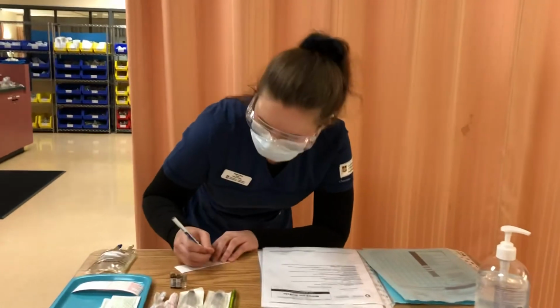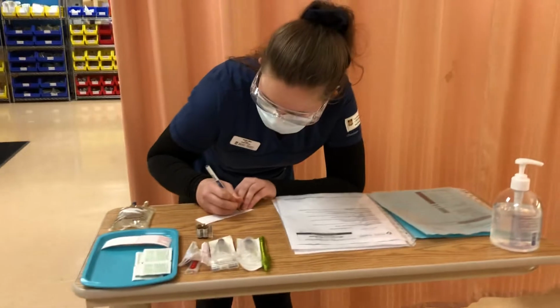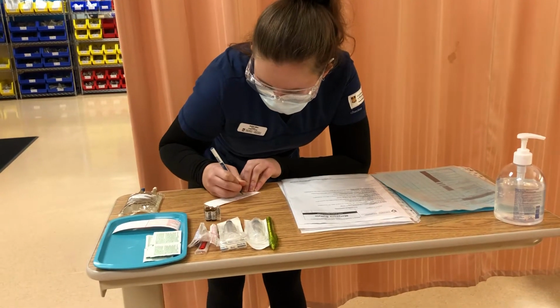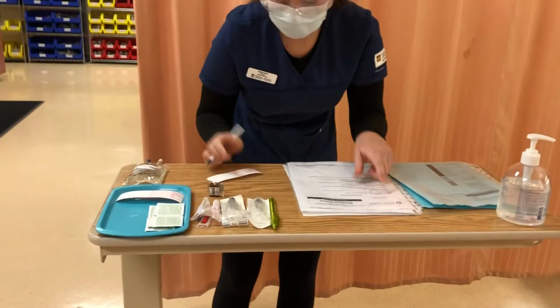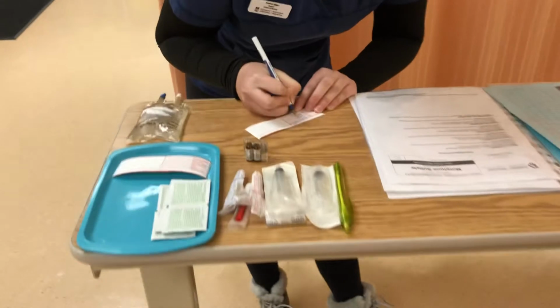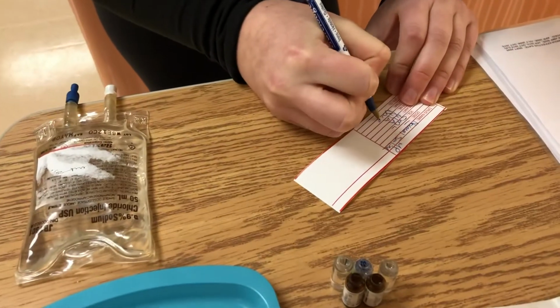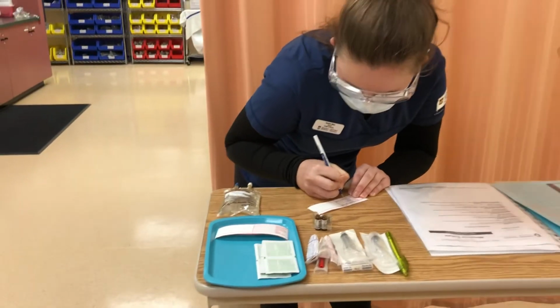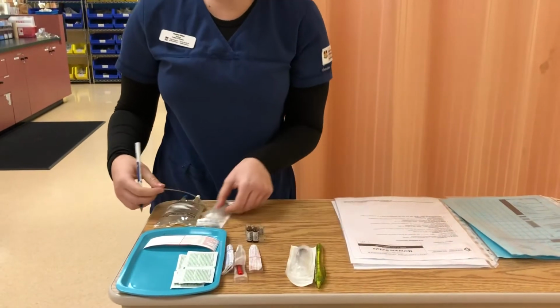So this is for Mandy Paris. This is just normal saline with a volume of 5 milliliters because 50 minus 45 is 5. There's no diluent in the syringe and the concentration is not applicable. So this is for November 20th, at 13:30, and I am Heather Milan, University of Manitoba student nurse 3. So this is going to be with the syringe to pull up the normal saline.